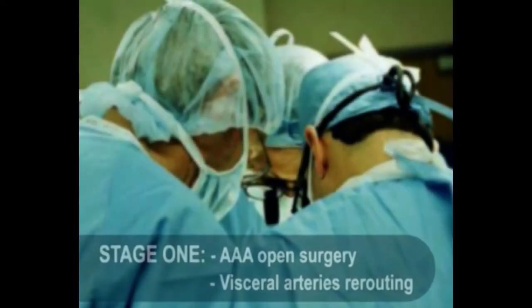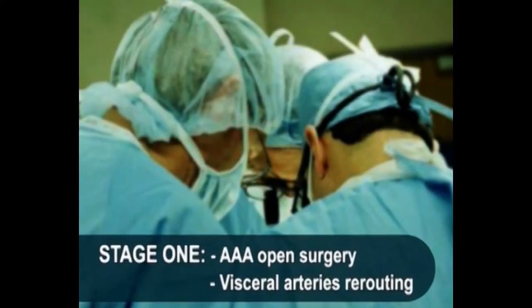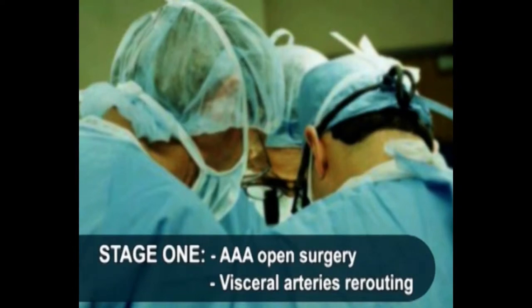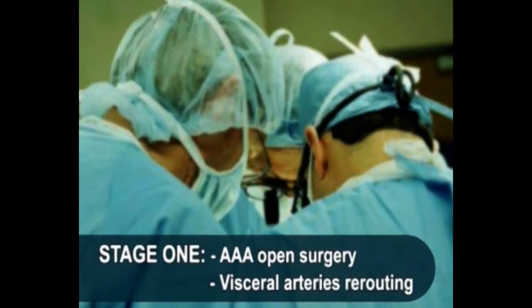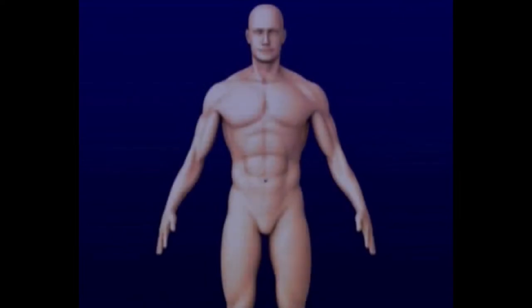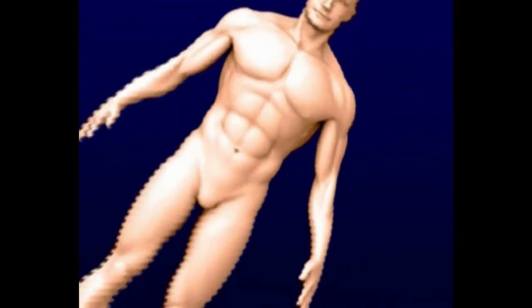A staged hybrid intervention was planned. In the first step, the patient underwent open repair of the AAA with visceral artery rerouting.